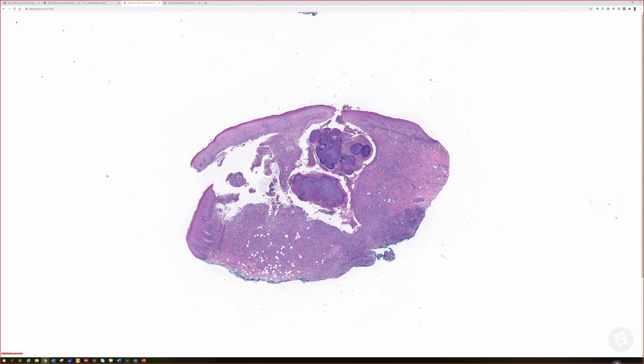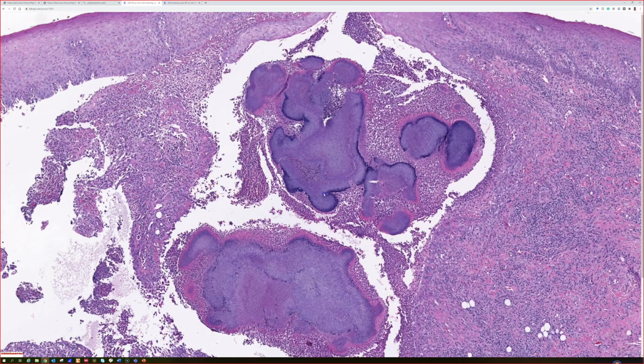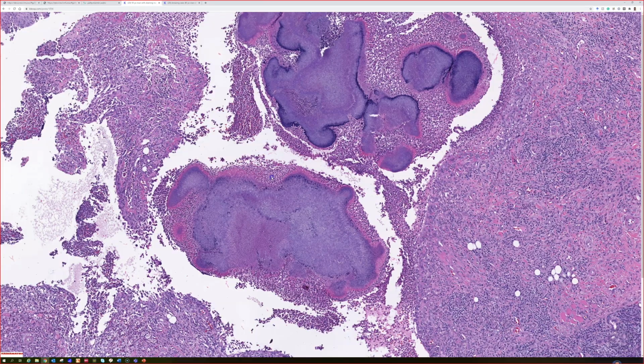The three main things I think of that make these globular structures that often have Splendore-Hoeppli around the outside: actinomycotic mycetoma, which is not actually fungal. If you think of mycetoma as a fungal nodule, Actinomyces isn't really a fungus, right? I think it's more thought of as a filamentous bacteria now. Actinomyces can do this. I've heard that Nocardia can do it, but the rare times I've seen Nocardia, it did not make nodules like this, so I don't know. But this is another example.